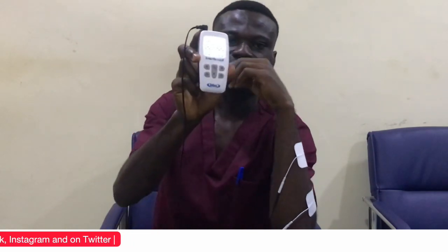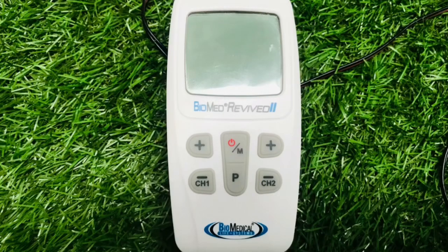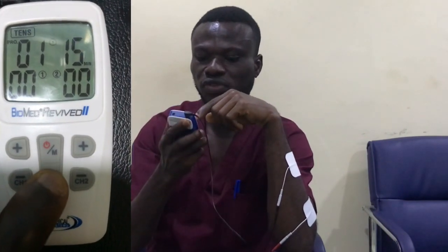After doing this, you then switch on your machine. I'm going to use the Biomed Revived — it's one of the TENS machines I've loved so far, it is very good. I'm going to use the TENS option. This is a TENS device, but it also has EMS and massage options. With the TENS option, I'm going to use the fourth program.